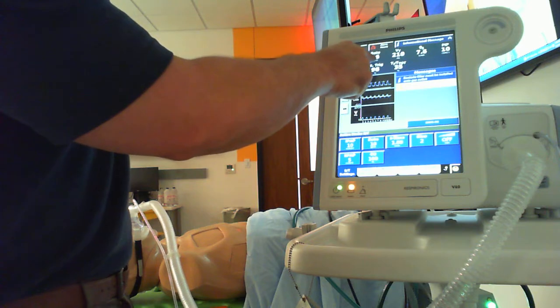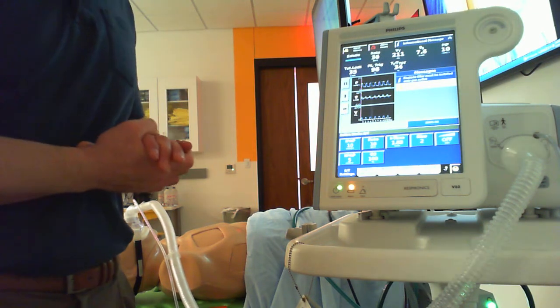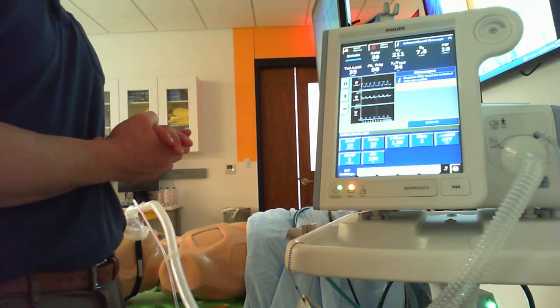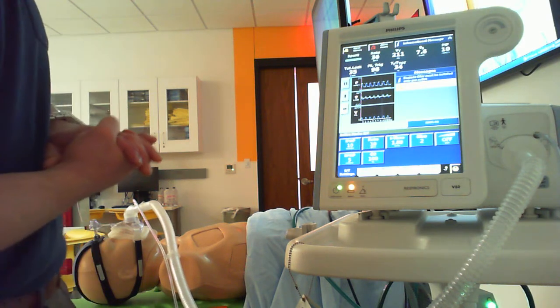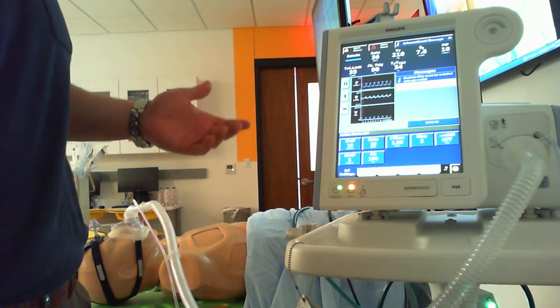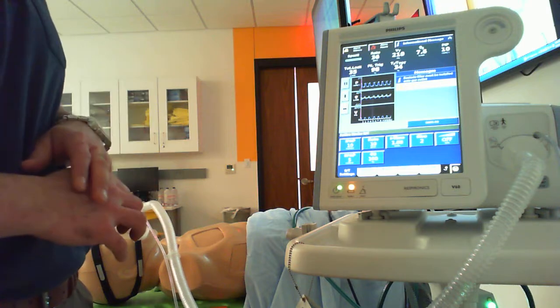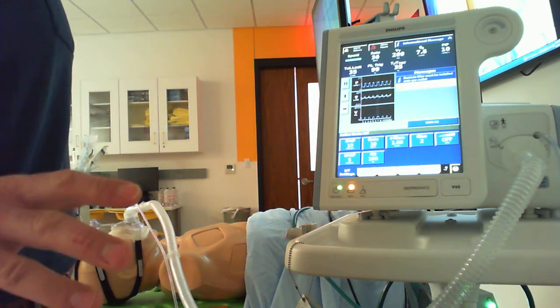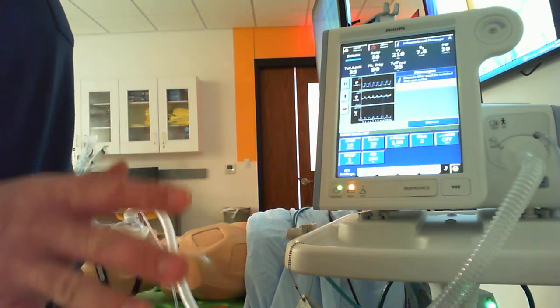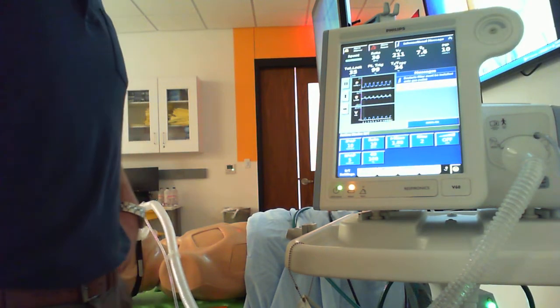So right now this guy's breathing 36. His tidal volume is 210 milliliters. He is not receiving an appropriate amount of pressure support. So I don't like to generalize, okay? Really, the goal with BiPAP is to deliver not huge breaths, just more seemingly normal breaths, but let the machine do most of the work. Ideally, we like to shoot for about a 6 mil per kilo tidal volume when we are initiating ventilation. All right. Sometimes we don't know that patient's height right away.